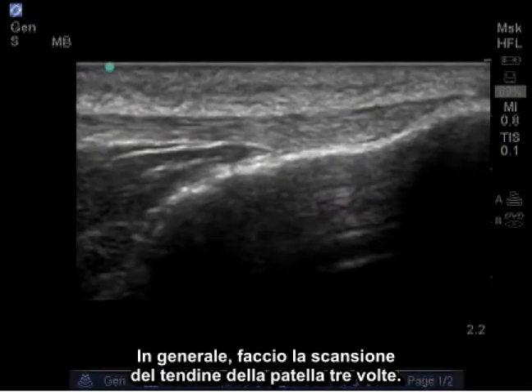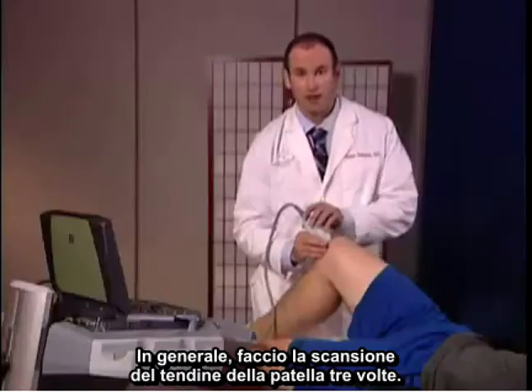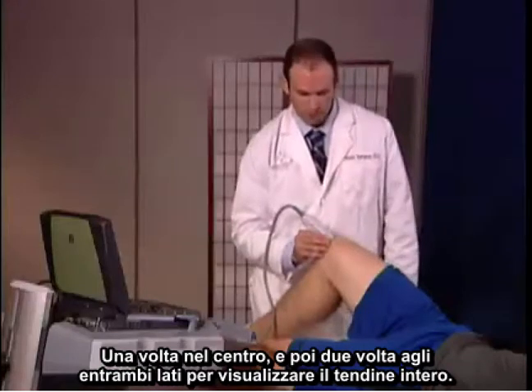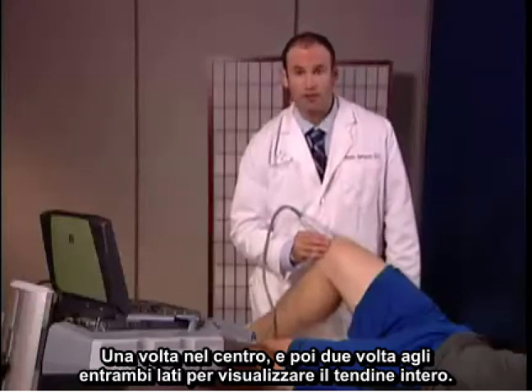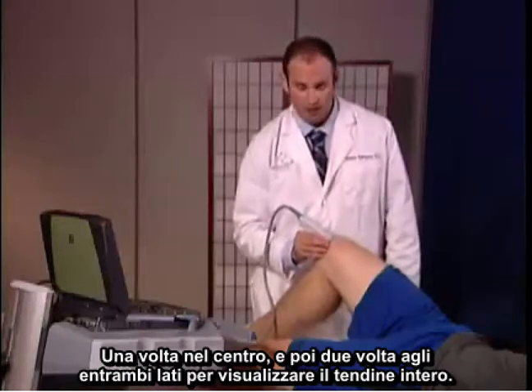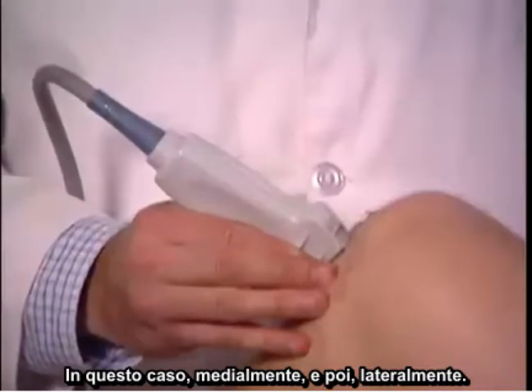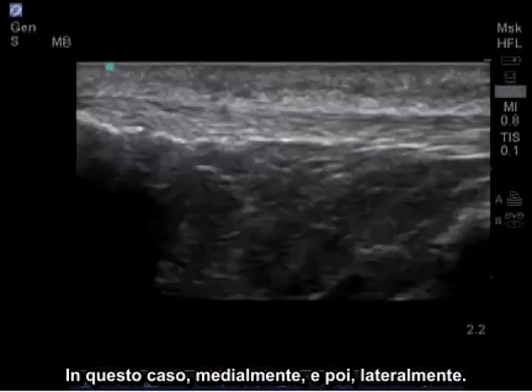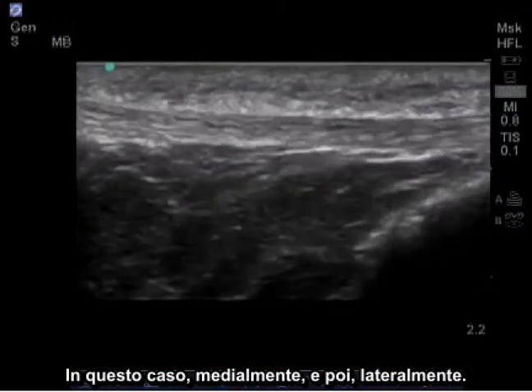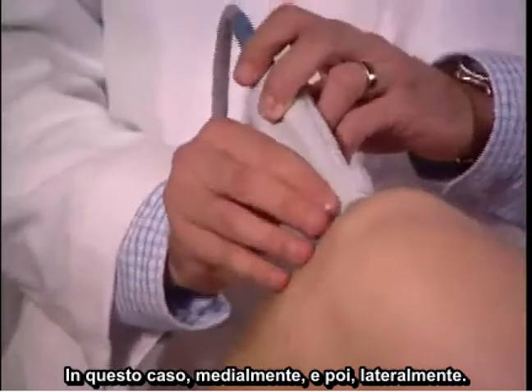Generally, I'll scan the patella tendon three times: once in the center, and then once to each side to view the entire tendon — in this case, medially and then laterally.